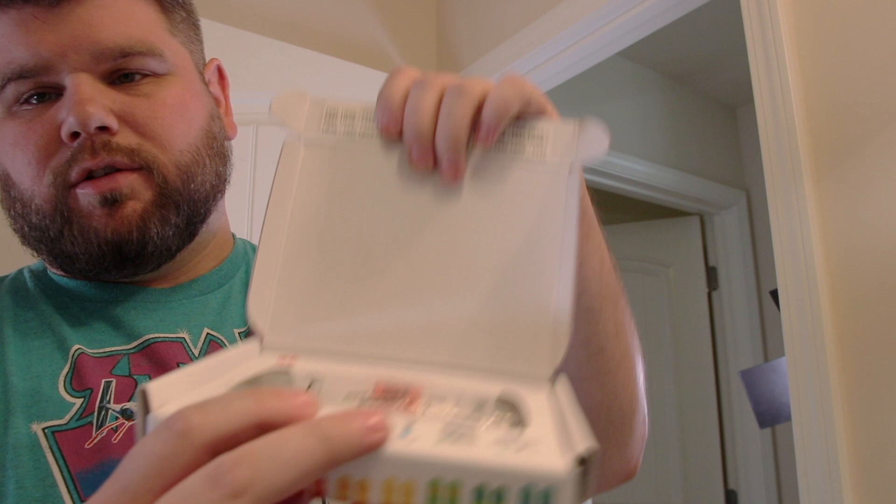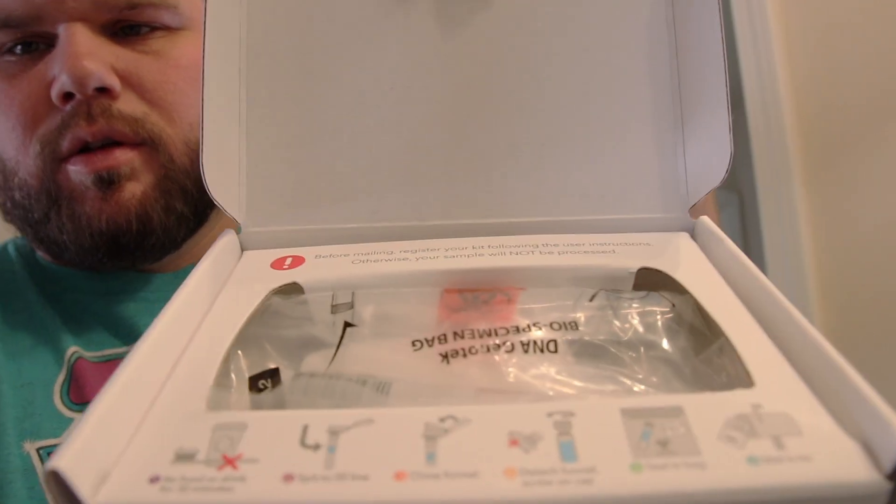There's a little checklist in the box. Once you register it online you can actually go through the process and the steps and it explains everything to you. So just going through the checklist: don't eat or drink for 30 minutes — check. Spit into the fill line — check. Close the funnel — check. Detach top — check. Screw in the sealed bag — check. Ready to mail — we are good to go.